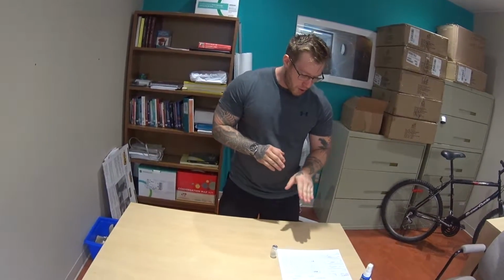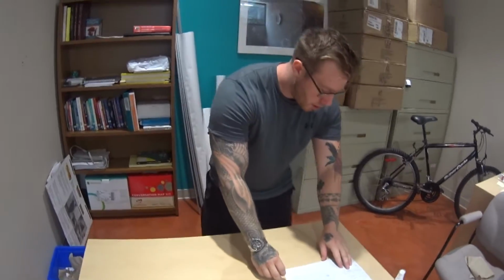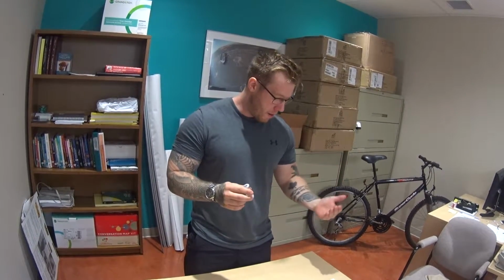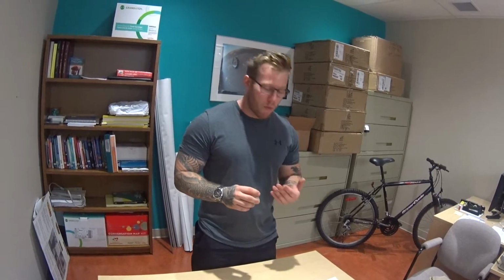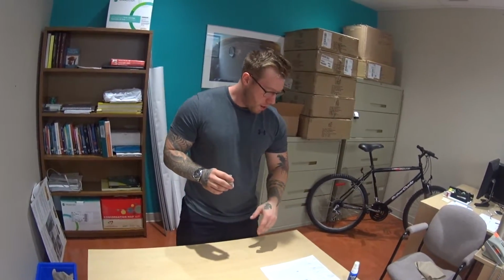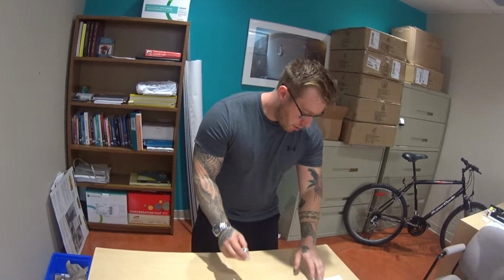I'll speak about the 10 rights right now. So again, we have the right person, Joe Milton, on the medication, and the right medication, haloperidol Haldol. Awesome. We have the right dosage, so we know it's a 2.5 milligram IM injection. This, like I said, is 5 milligrams per 1 ml. So we know that we have a 2.5 milligram IM injection, therefore we need to have a 0.5 milliliter injection. That'll be our med calculation. So that would be the right dose.